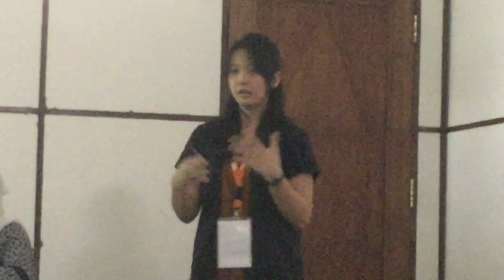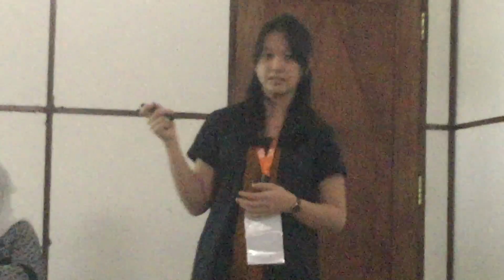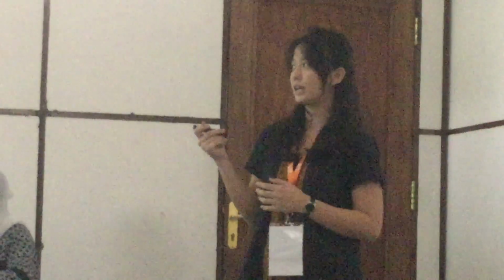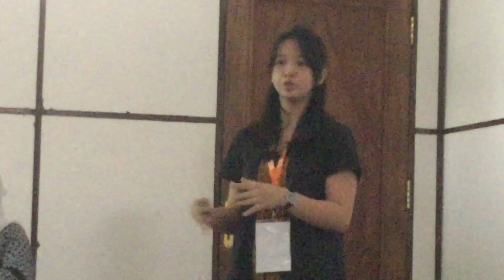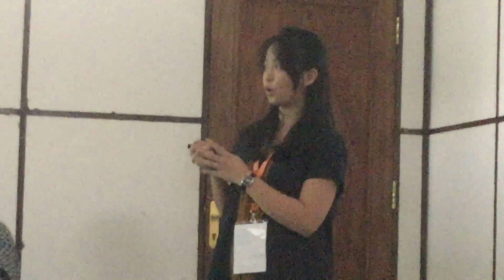But when we try to look, we have seen these 3 errors are present. The first one is in the preprocessing. The preprocessing error actually lies in the hole filling. The hole filling algorithm misidentified the background as a hole to be filled. It happens when the erythrocytes are forming this so-called border.